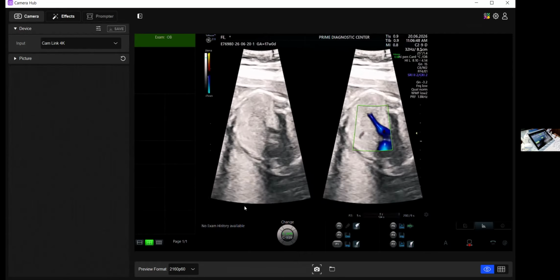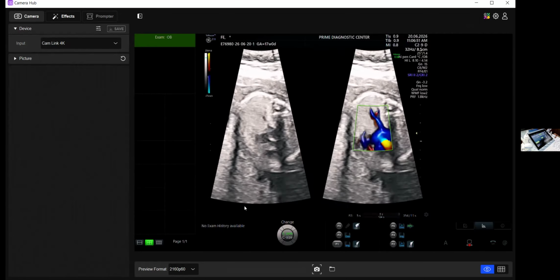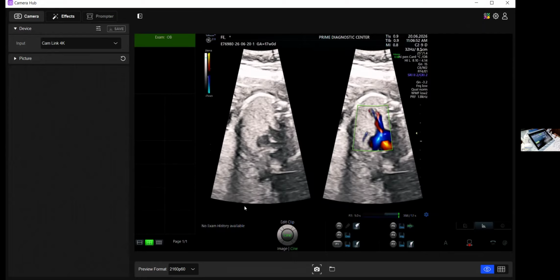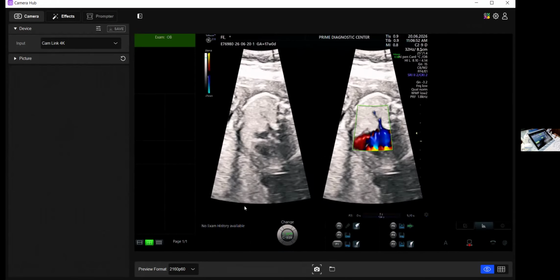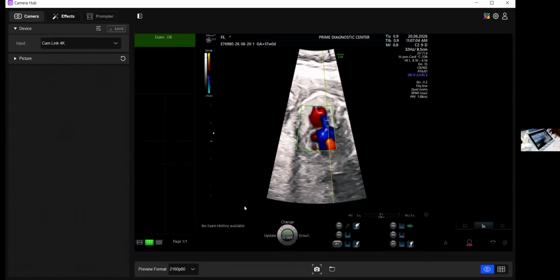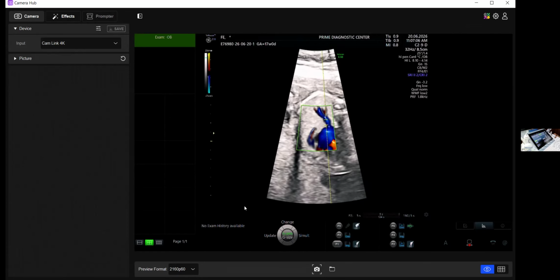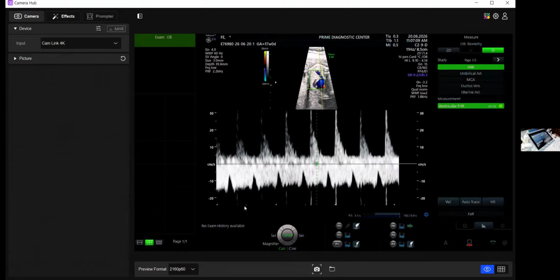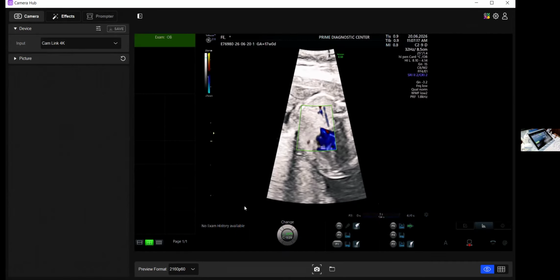Okay. So now you can see the pulmonary vein, and do you see the pulmonary artery along with it? That's the pulmonary vein and pulmonary artery. So that again is kind of a DV look in the pulmonary vein, and you see the pulmonary artery along the side. So that's done. Pulmonary vein we've done plenty of times and effortlessly.